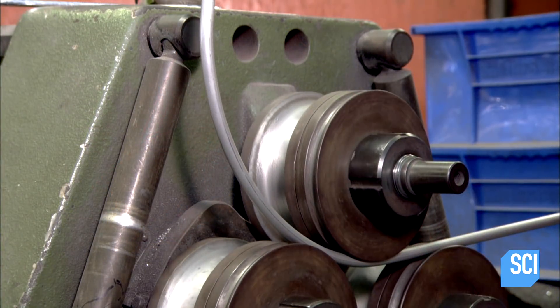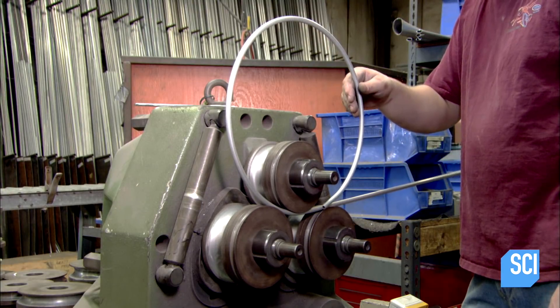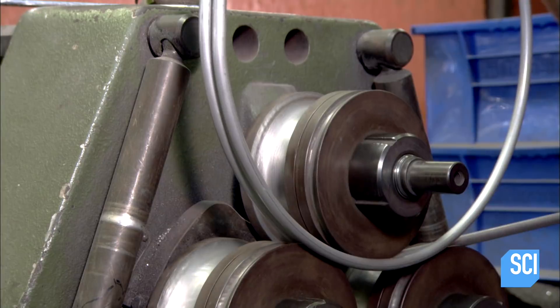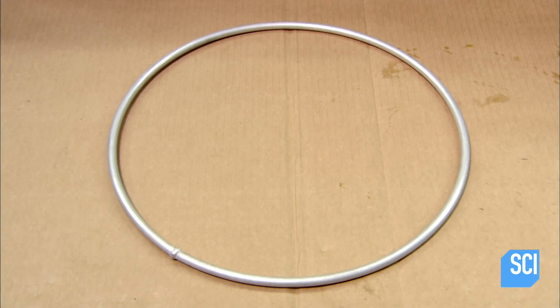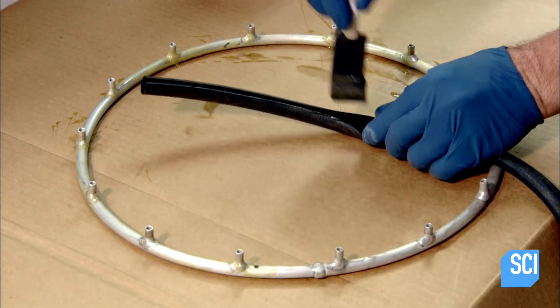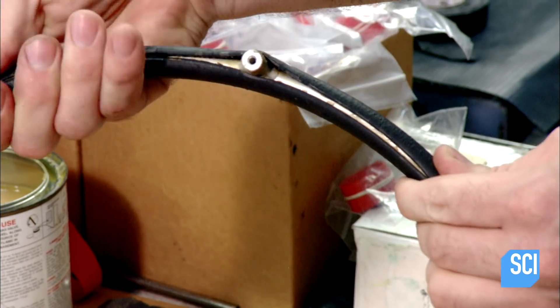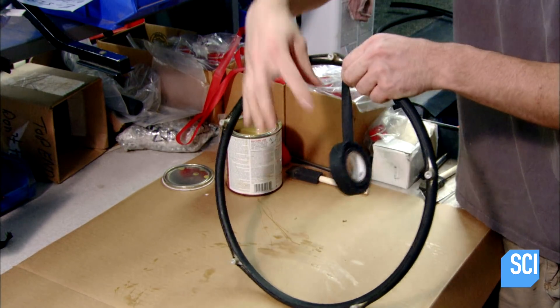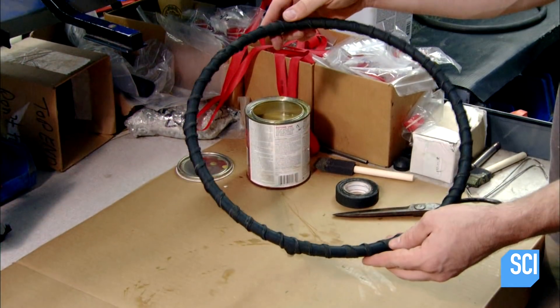Next, a machine rolls the push rims, which the athlete uses to propel the wheelchair. They weld on pegs for attaching the rims to the wheels, then glue a rubber sleeve onto each rim. They wrap it in tape to clamp the two as the glue dries. The tape stays on until the chair is delivered to the customer.